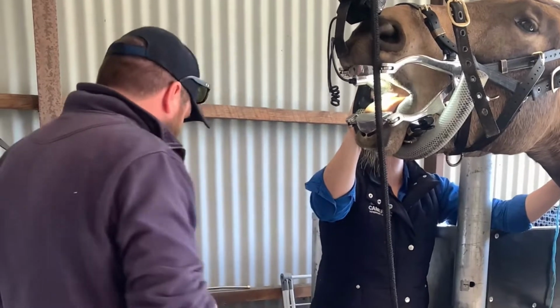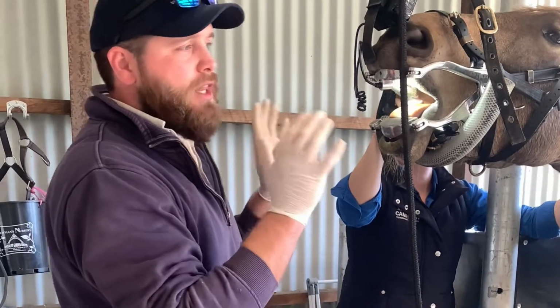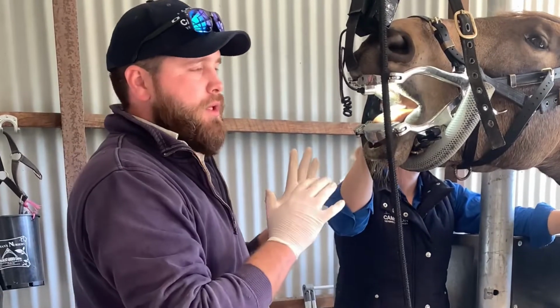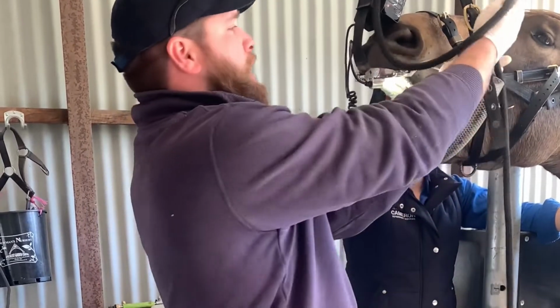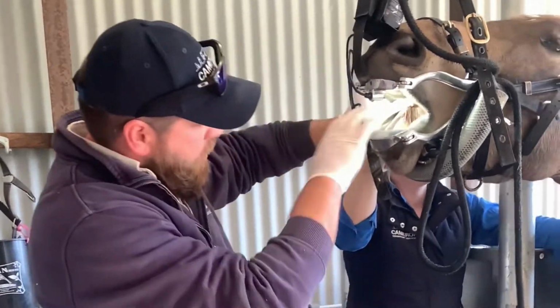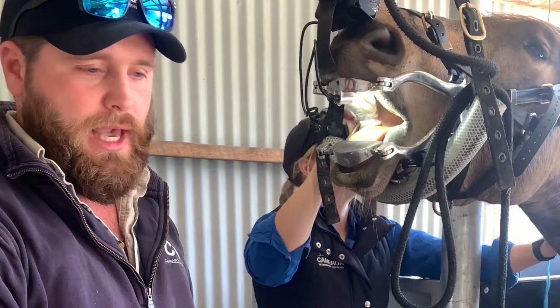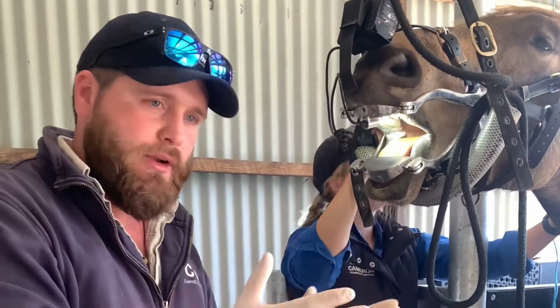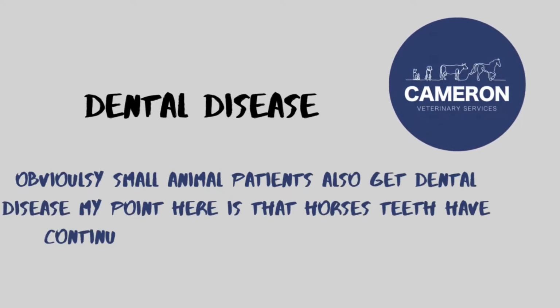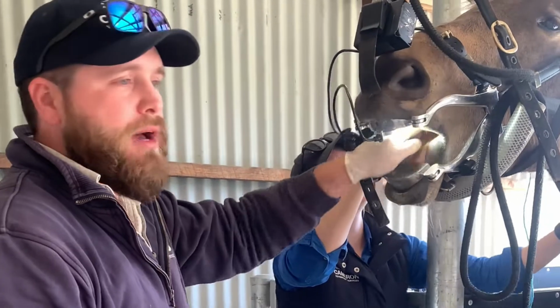Unlike dogs, cats, humans, horses' teeth continue to erupt over their lifetime. So that's why they need regular dentals to curb the sharp points that start to develop. We can probably do another video on the reasons why we start to develop sharp points in more consistent places, especially in domesticated species. But for now, all we're going to do is show you the process of floating the teeth. That's in comparison to a dog, a cat or a human, where their teeth, once they're erupted, they're in place, that's it. These guys continue to erupt and they'll continue to have dental disease.